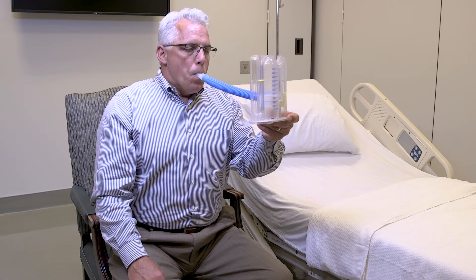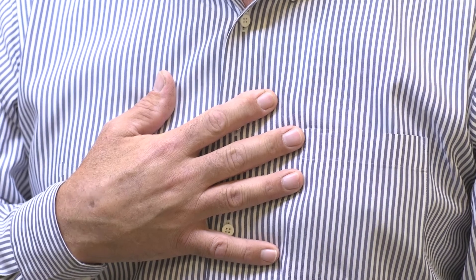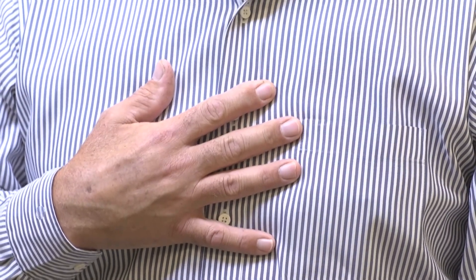After each time you complete 10 breaths using the IS, give 3 deep coughs. Support your incision when coughing by holding a pillow or hand firmly against your incision site. Even if you don't cough anything up, this will help clear secretions from your airway.